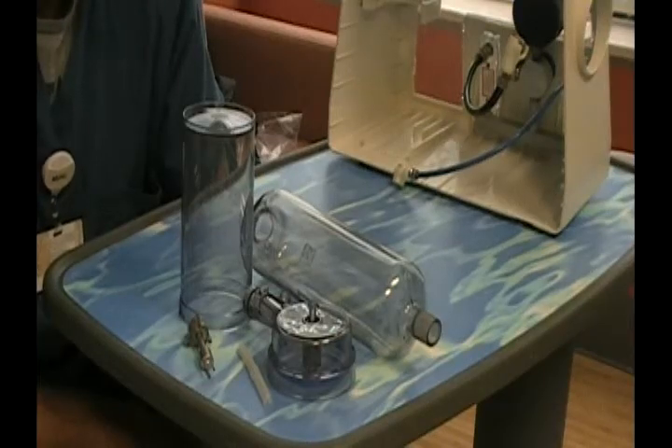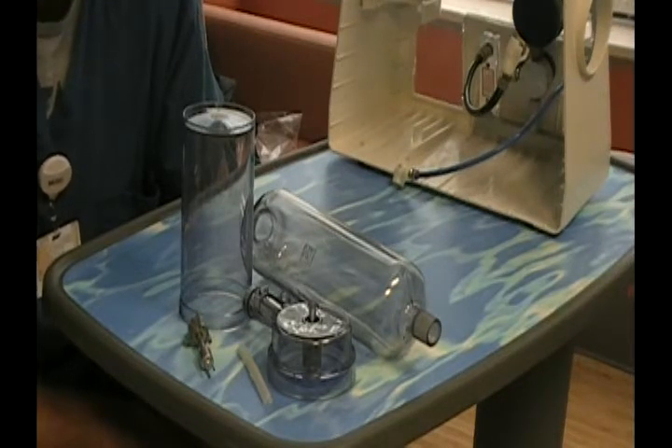Hello, this is Scott Krega, Respiratory Therapy. We're going to go over the setup of the SPAC-2 generator. This is the nebulizer that delivers the ribavirin, or the virazole, for patients with an RSV colonization that are showing signs of respiratory distress.